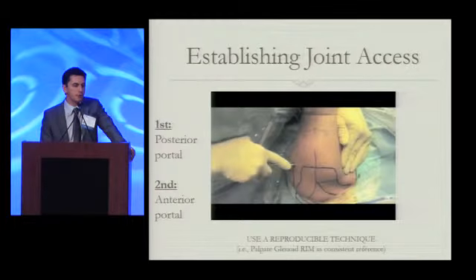So our first posterior portal is going to be established before our anterior portal. It's an inside-out technique in most cases.